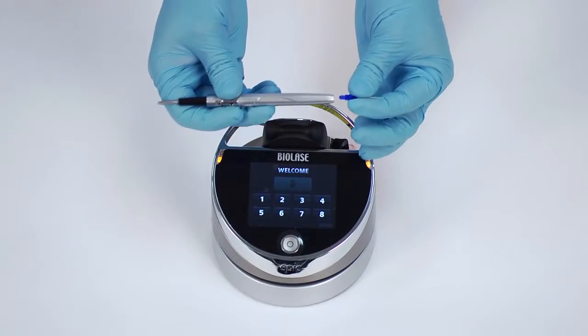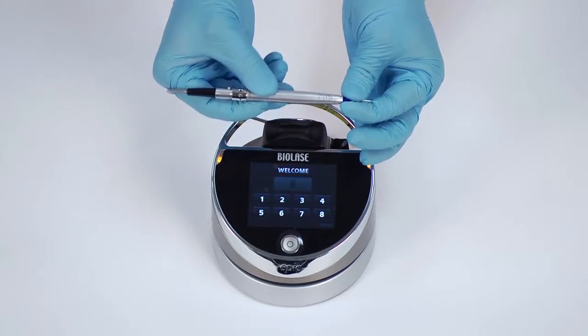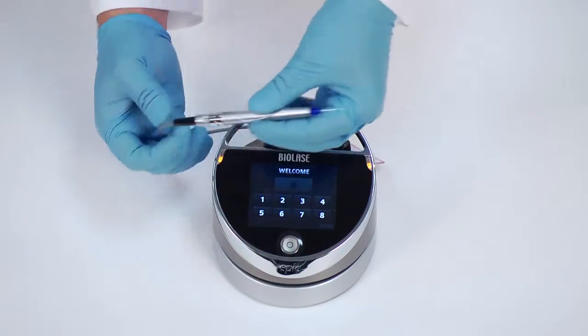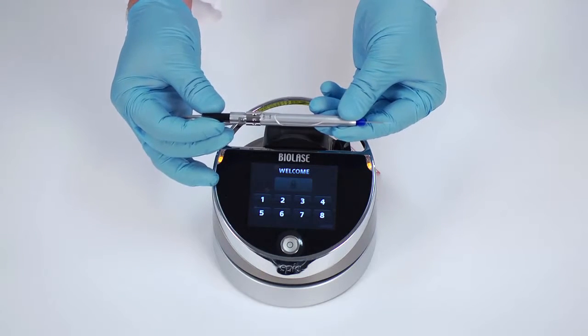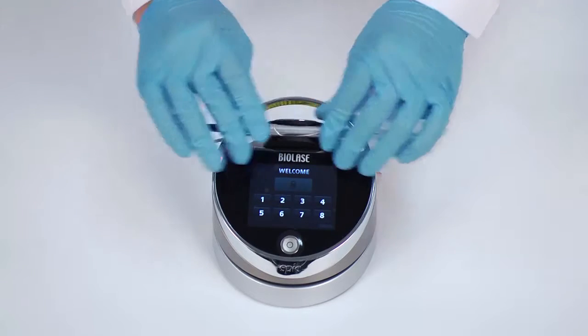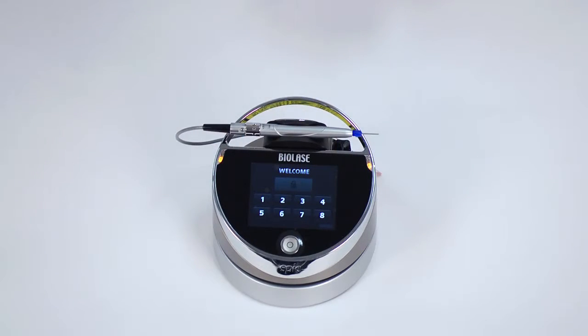Insert the selected tip and tighten it clockwise until snug. Wind any excess fiber optic cable onto the fiber spool counterclockwise around the base of the console. The handpiece is now ready to use. To store the handpiece, place it in the handpiece holder located at the top of the laser console.